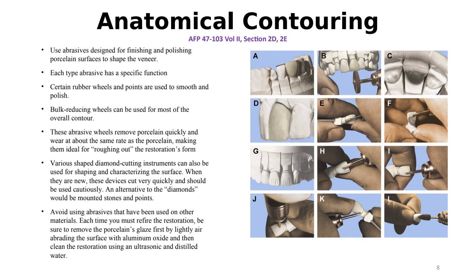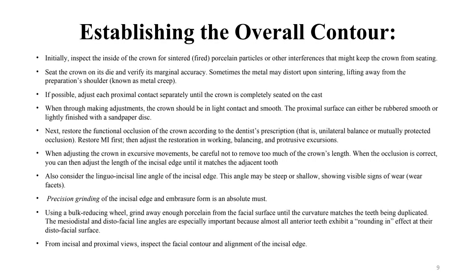What I used to do, I would dip my finger in water and put a little bit of water on the surface, so it acts like it would in the mouth with the saliva. And then I see, oh, okay, maybe I need to make the groove a little deeper because I can see it too much if I apply the glaze, right? So those are things that you find out doing it, from experience.